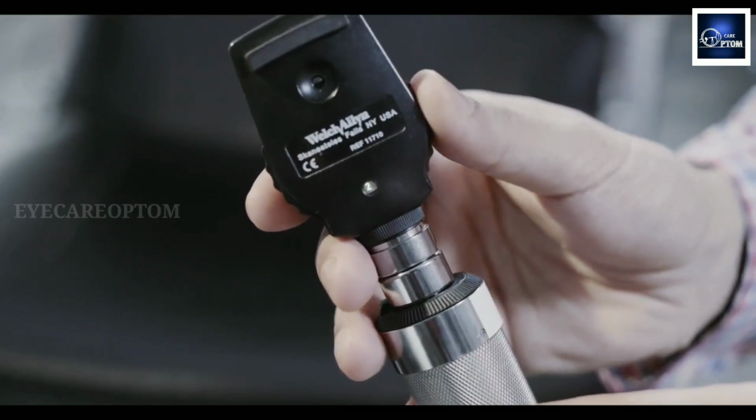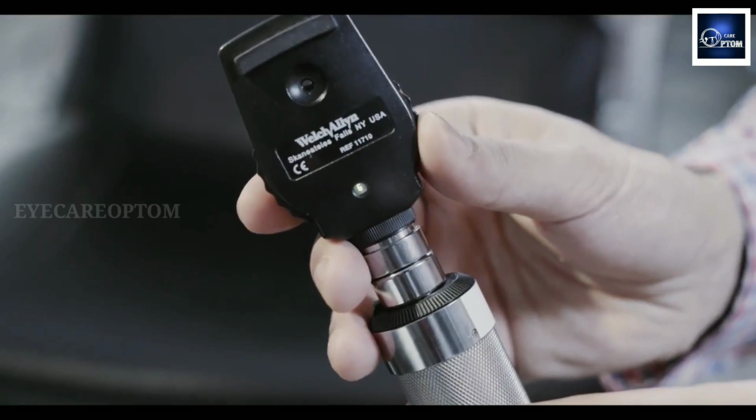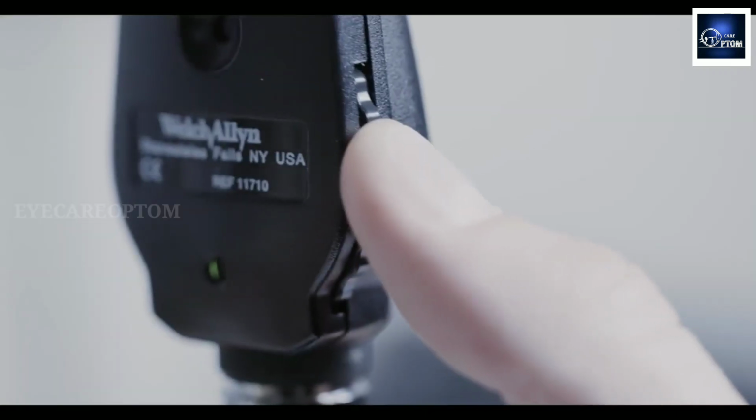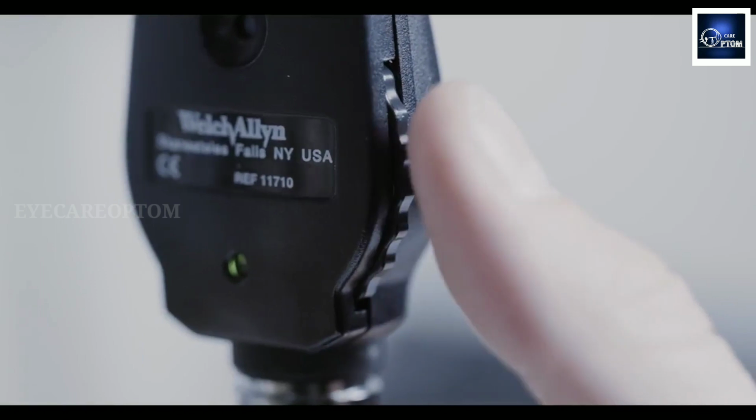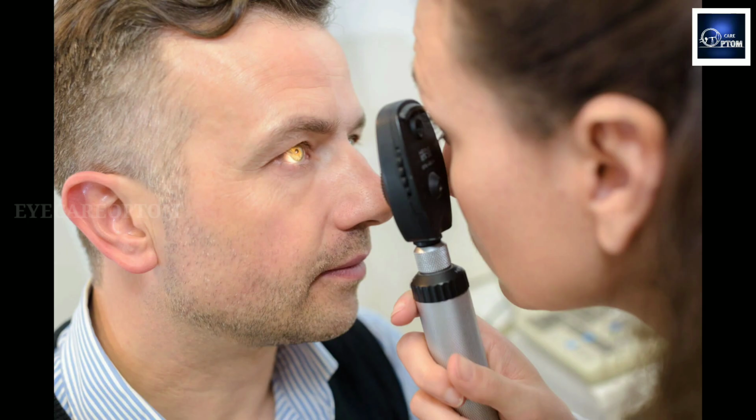Before starting, we keep this at 0, keep the brightness on full and set your aperture size. Set the room illumination; it is usually done in a semi-dark room. It will be done in a sitting position. Ask your patient to look straight.